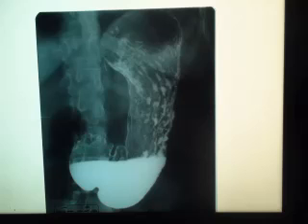You can have some important questions over this X-ray. What are the complications of the duodenal ulcer? How can you treat this patient? And for sure, you know that the ideal treatment for this patient is truncal vagotomy and gastrojejunostomy as a drainage operation.